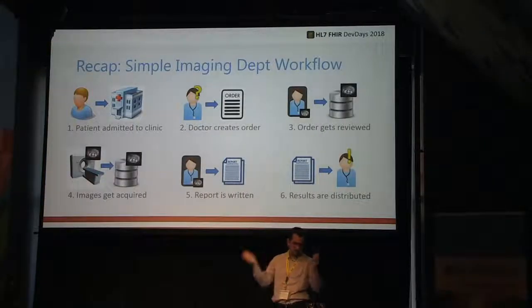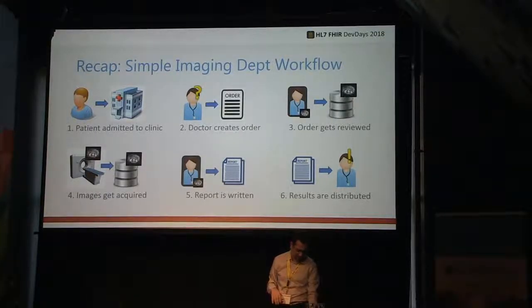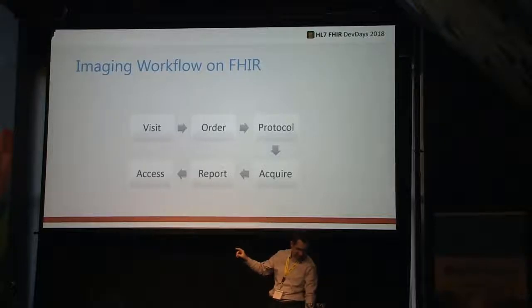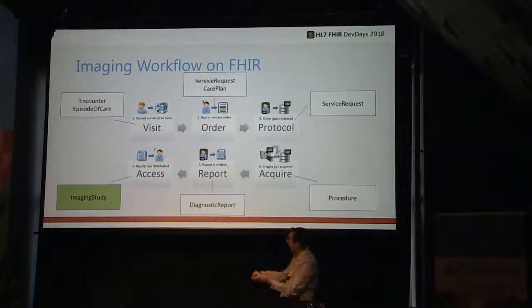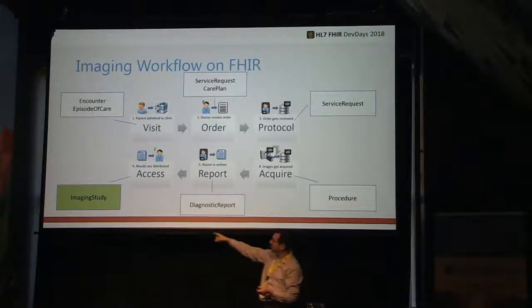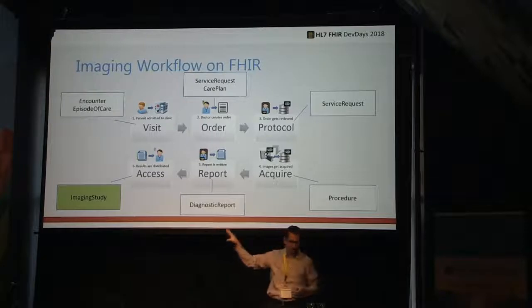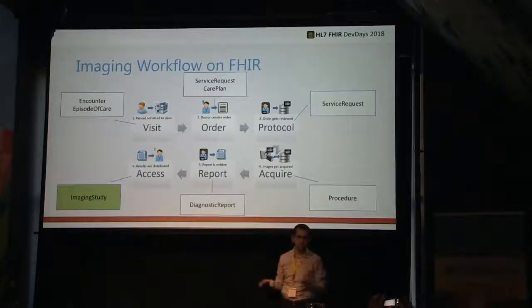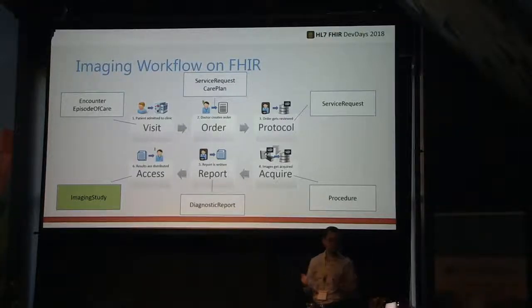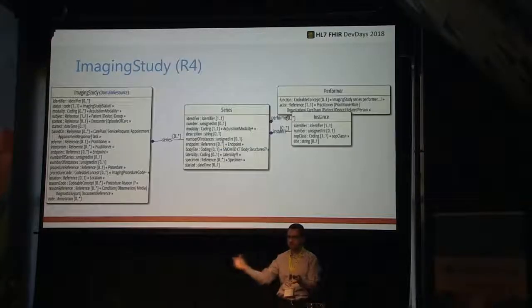So if we, once again, familiarize ourselves with the typical workflow. Now, I do apologize. This one slide is slightly reversed, but Brad did it for a reason. Really, what matters is, so he reversed the bottom row. But anyway, imaging study is the long story short of what we want to do. So in FHIR, you've got all these resources that represent the different pieces of the workflow, and then imaging study is that link between the rest of the patient record and their images.